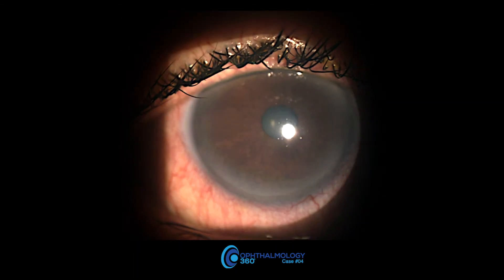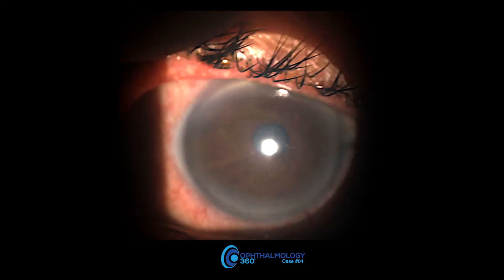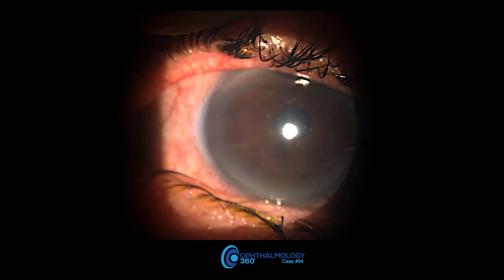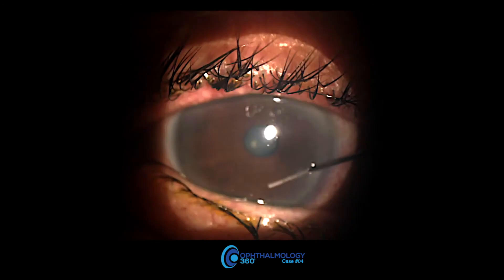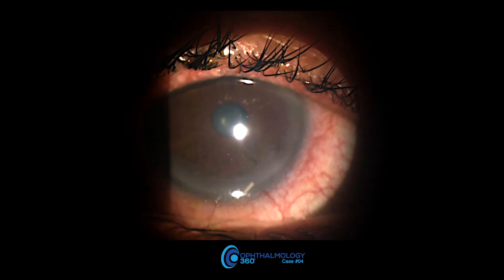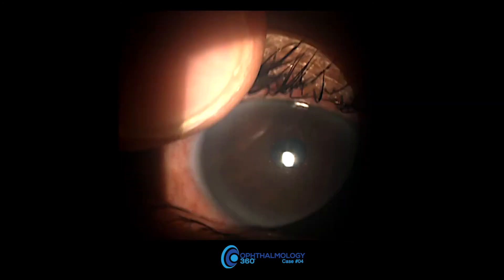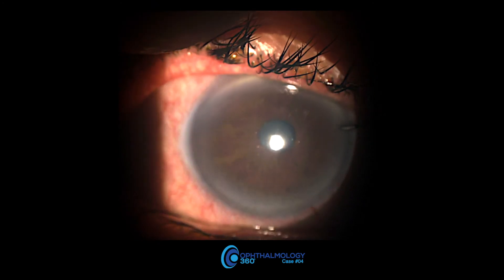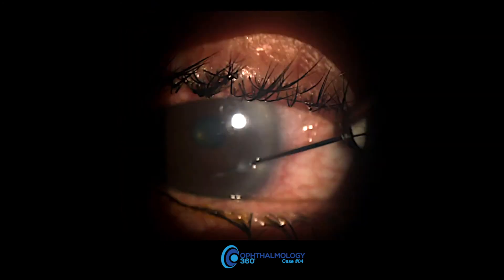Some patients have a pretty good blink reflex or floppy lids, so it also depends upon who in your office is holding the lid. Be patient. Talk to the patient while you're doing this — tell them just to relax, we're going to hold your upper lid. You can see I'm using counterpressure on the lid with my finger.